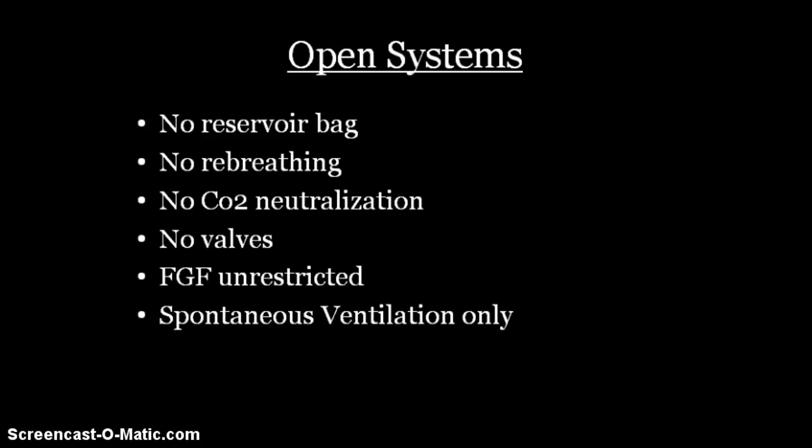The open technique is useful for pediatric inductions when the patients are non-compliant with masking, and with bronchoscopy during brief periods of apnea. While these systems do deliver anesthetic gas to the patient, they do so very inefficiently and with little control of the delivery.